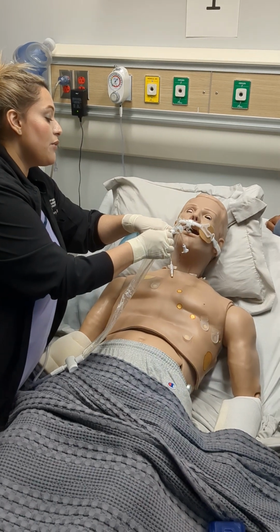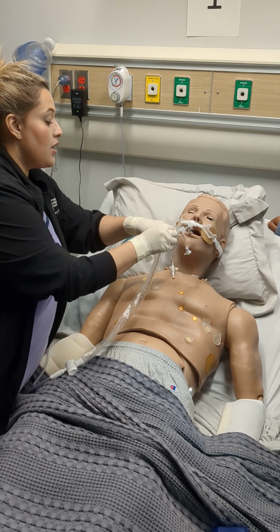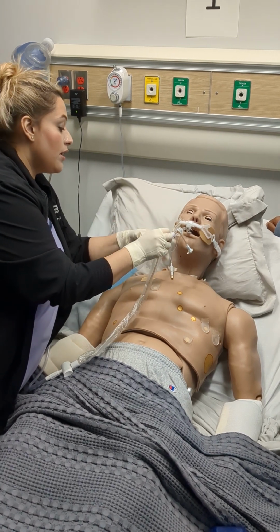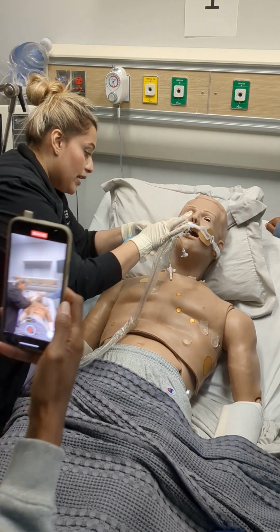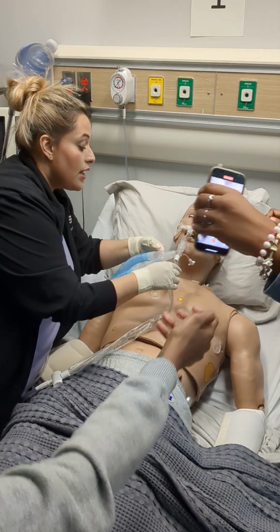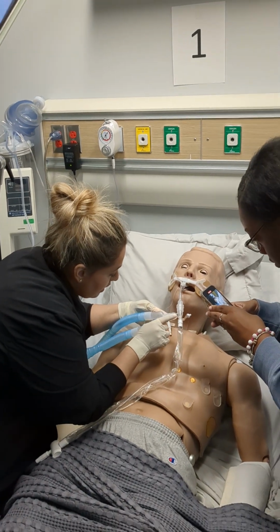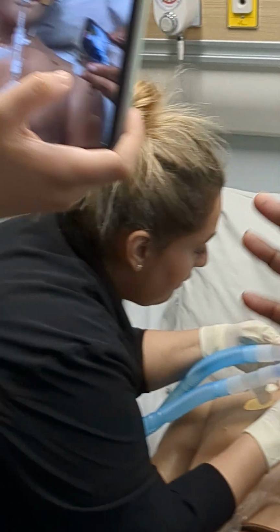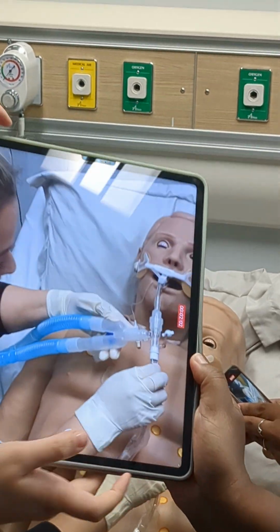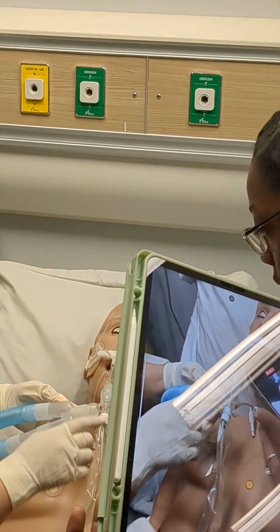So when you leave your patient, you wanna make sure that you leave this suction catheter in this window right here, so that it doesn't create an obstruction. I want you to look at the windows. So you see how here the patient's receiving the oxygen from here? You don't wanna obstruct it like that. You wanna leave it out of here. Okay, I see it.